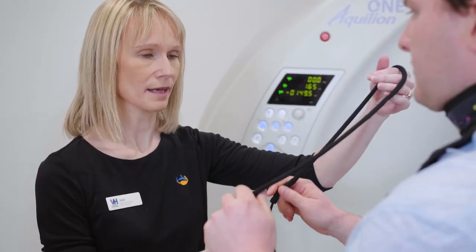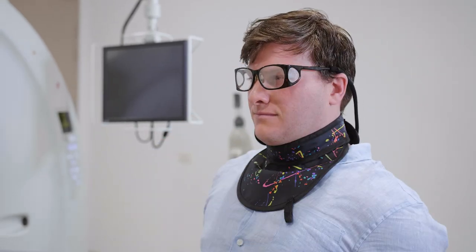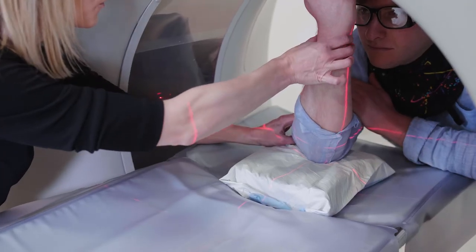When the Aquilion ONE was first installed, we had two weeks of on-site applications training. This was a fantastic opportunity for all of the technologists to get hands-on training and be confident in our day-to-day work once the application specialist left us.